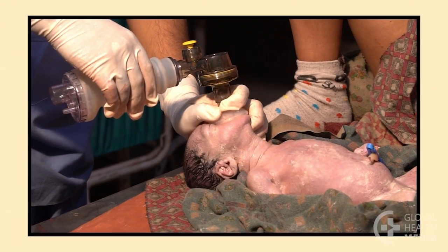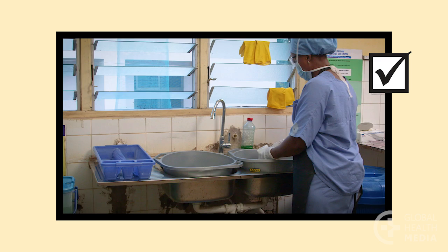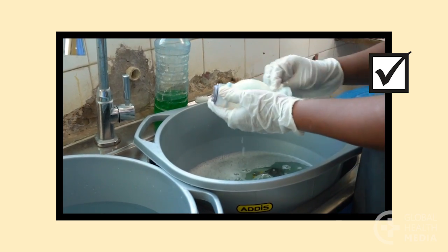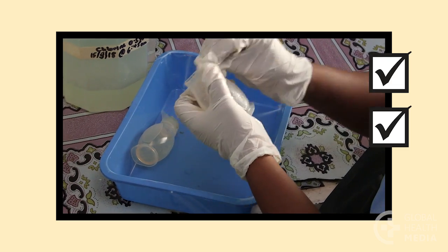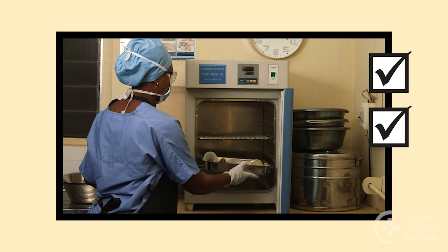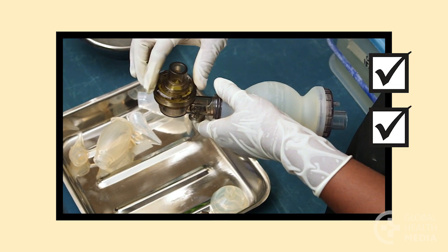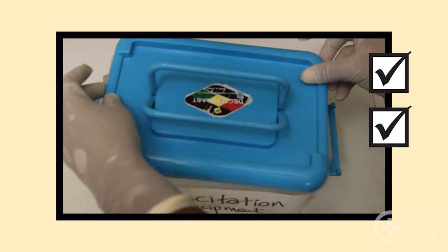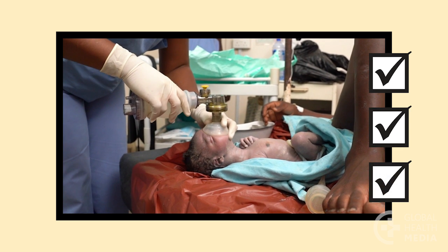Remember, to prevent the spread of dangerous germs, thoroughly clean your resuscitation equipment. Follow the steps. Wipe the equipment, take it apart, clean, then disinfect it, dry, then put it back together, test, and store it. Make sure your equipment is safe for the next baby.